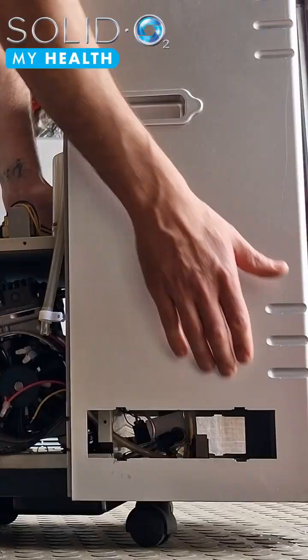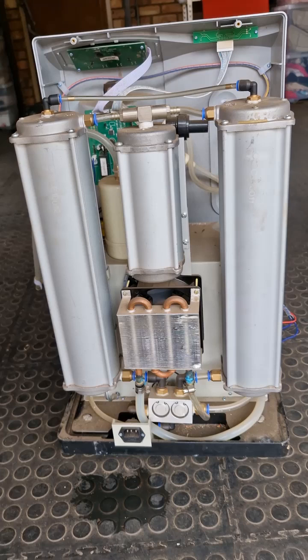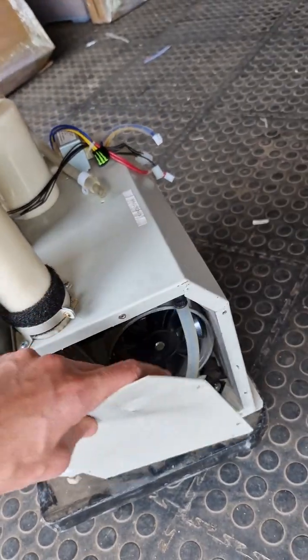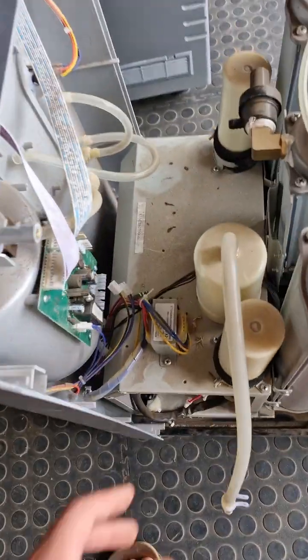For this particular model, we only need to slide the back off. We do not want to disconnect any wires. We do not want to disconnect any pipes unnecessarily. So with this model, as I said, we remove the back cover, exposing the sieves, exposing the small radiator, exposing the fan, and in some cases, if you really want to go deep, you can go into the compressor. I don't recommend it because usually this is sealed and the air inside there is already going through filters before it gets to the compressor.